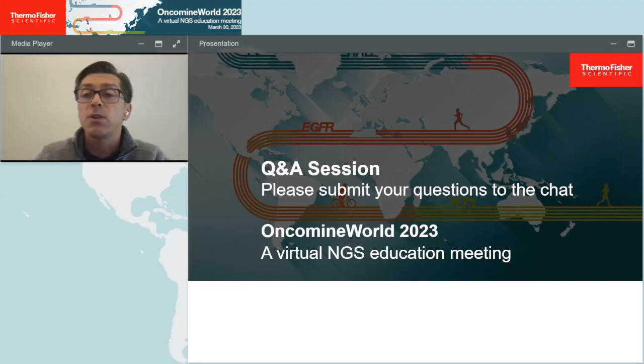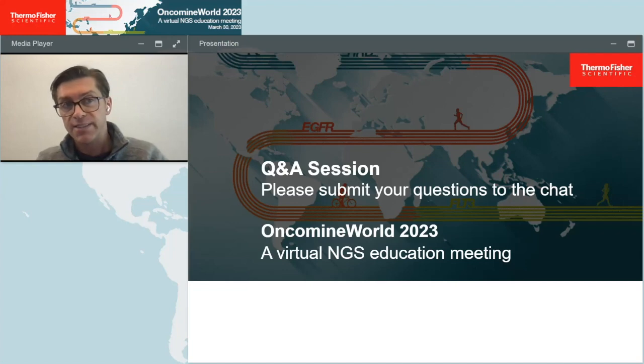All right. Can I run multiple assays on the instrument at the same time? So yes, you can run multiple assays on a Genexus chip at the same time. There are 4 lanes, and you can run up to 4 assays, 1 assay per lane. The only caveat is that you have to make sure you're running the same chemistry. So that would be AmpliSeq assays altogether, or AmpliSeq HD assays altogether. And those assays also have to share the same thermocycling profile for the library prep portion.